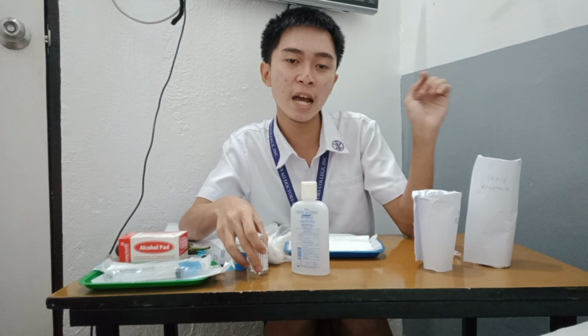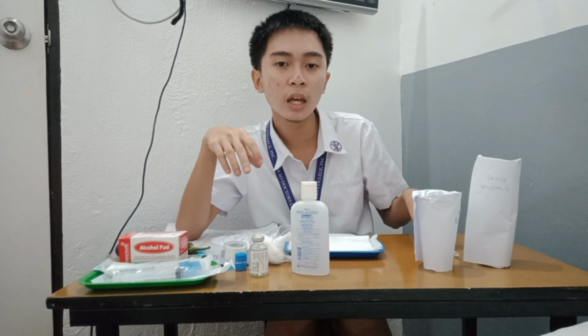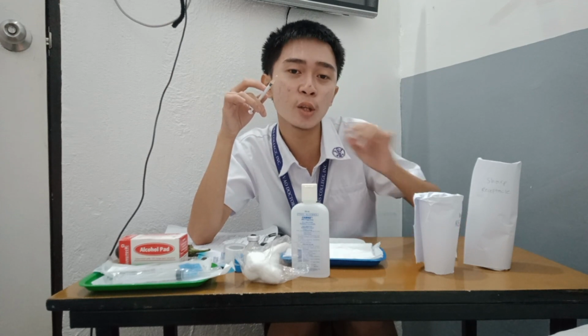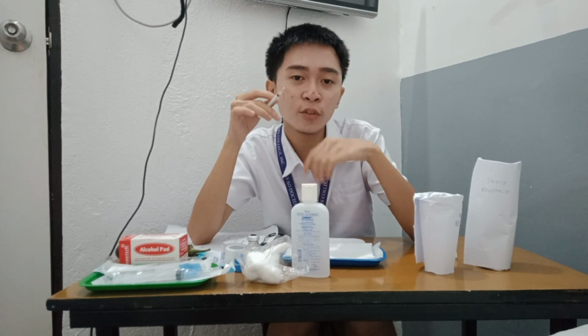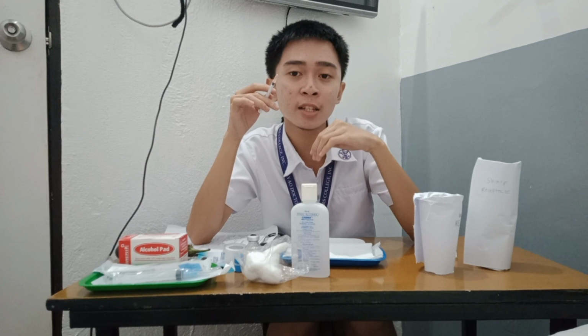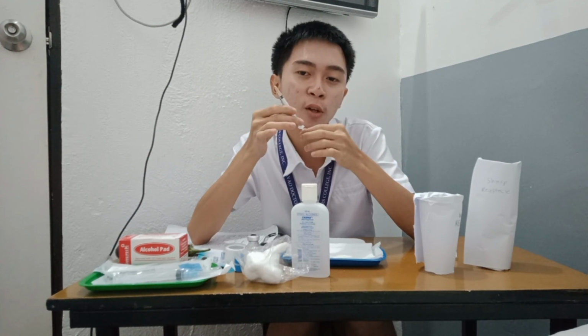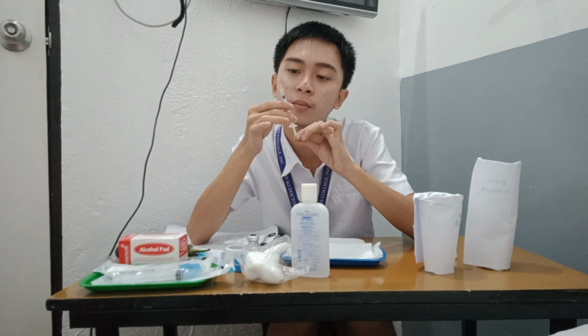Withdraw the medication and attach an aspirating needle as agency practice dictates to draw up premixed liquid medication from multi-dose vials. Ensure that the needle is firmly attached to the syringe. Remove the cap from the needle, then draw into the syringe an amount of air equal to the volume of medication to be withdrawn. After doing that, I'm going to get the syringe and uncap it. Then I'm going to draw air into the syringe, an amount of air equal to the volume of medication to be withdrawn.